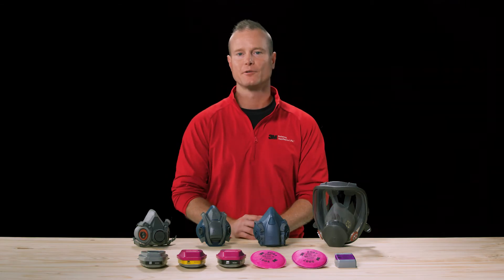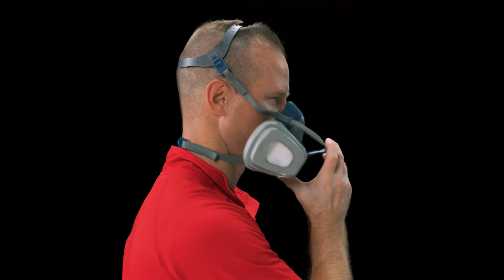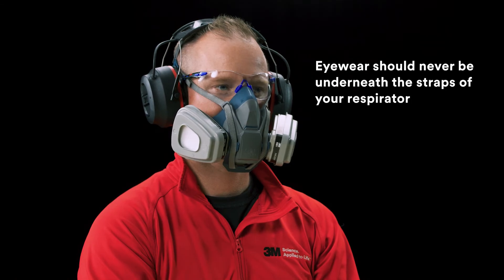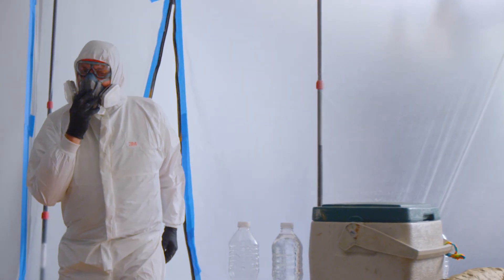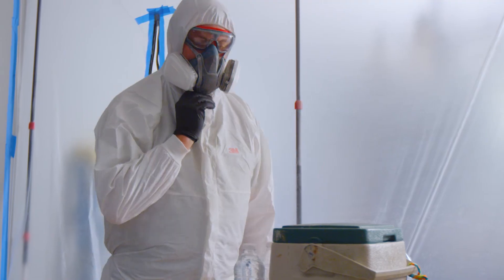There are two main types of reusable respirators: half face piece and full face piece. When using half face piece respirators, you want to make sure they are compatible with your protective eyewear. It's important to remember that your respirator should go on first and then your eyewear. Eyewear should never be underneath the straps of your respirator because they could impact the seal of the face piece. Some half face piece respirators like this 3M quick clutch respirator allow you to drop the face piece down quickly and easily without removing the head or neck straps. This is convenient when you're in non-contaminated areas — drop the face piece down to talk to someone or take a sip of water, then put it back on and pick up where you left off without removing any other PPE.